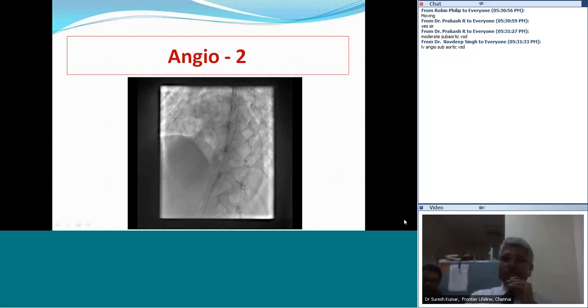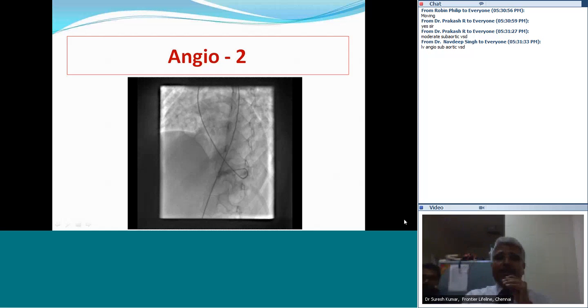Only Himanshu has answered now. What do others think? You would have liked it to be clearer. I understand. But is there a reason why it is less clear than you would like it to be? Obviously, there is a VSD. In fact, the problem is that there are several VSDs.